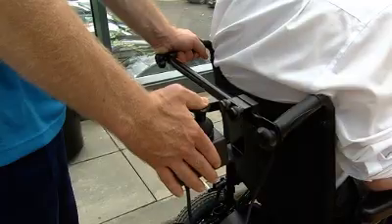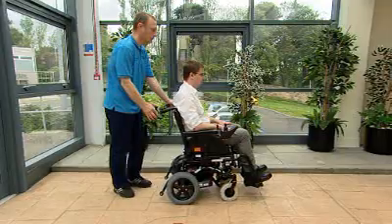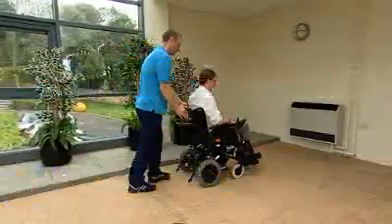Then, looking forwards, gently push the attendant control joystick very slightly forward. You will hear a loud click as the brakes disengage. Push the joystick slightly further and the wheelchair will begin to drive forward.